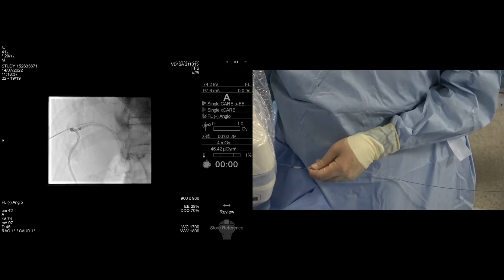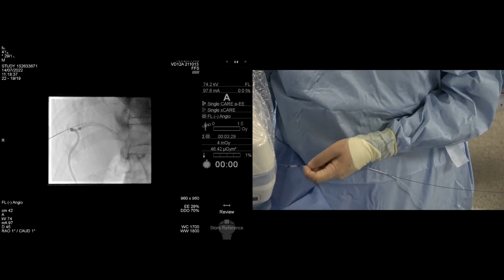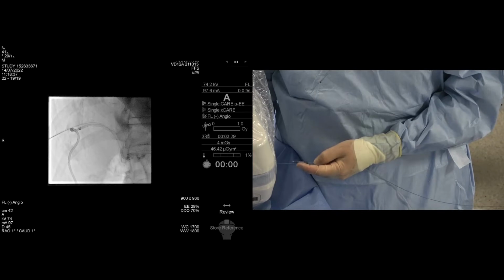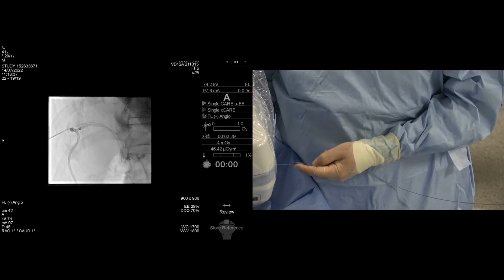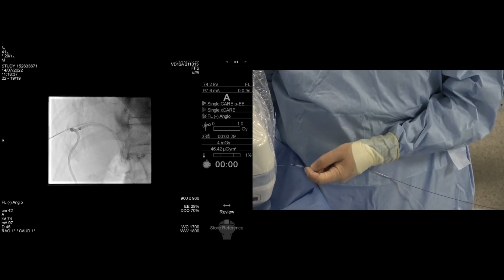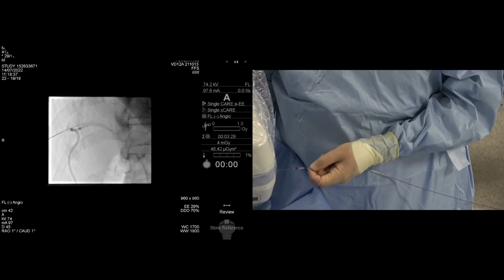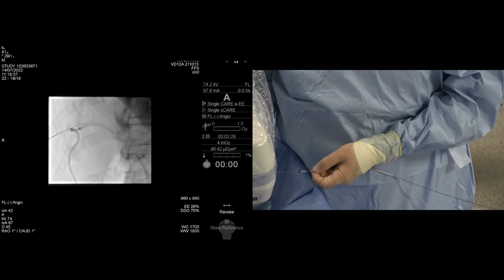The particular features of this brush, which we may have discussed, are that it has three bristles, a stiff black set of bristles at the tip, and the same stiff bristles at the back. The aim of that is that they excoriate the mucosa and allow a better cellular yield, and then the soft white bristles in the middle capture those cells.